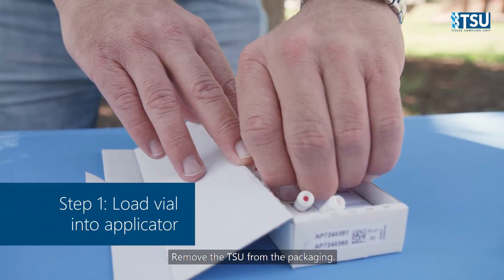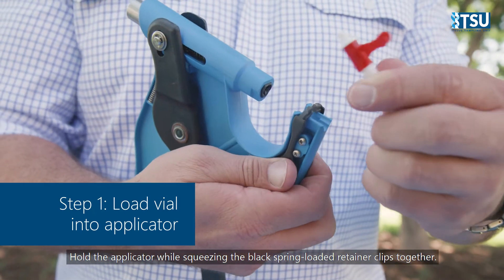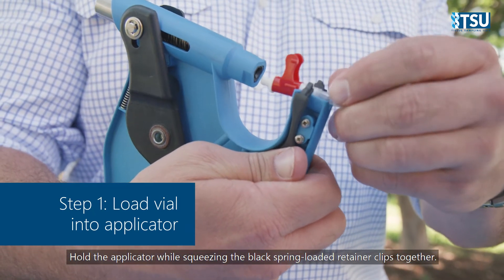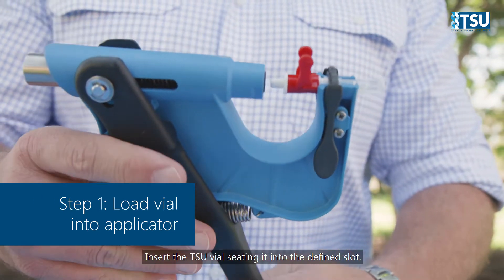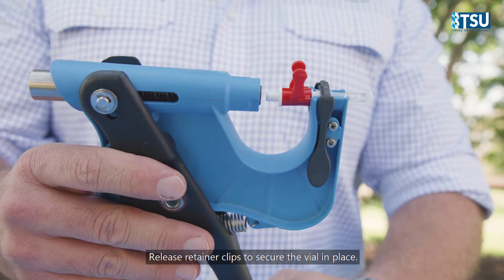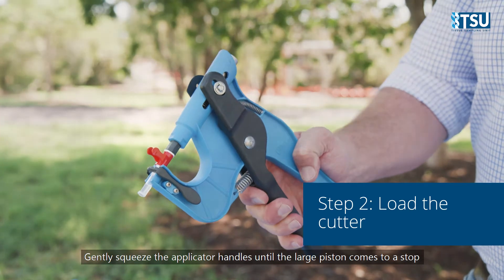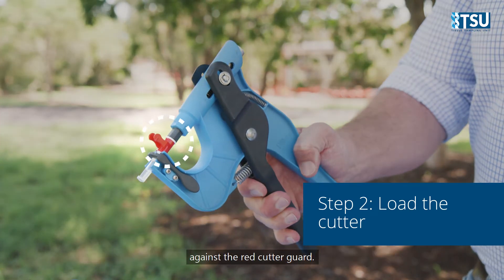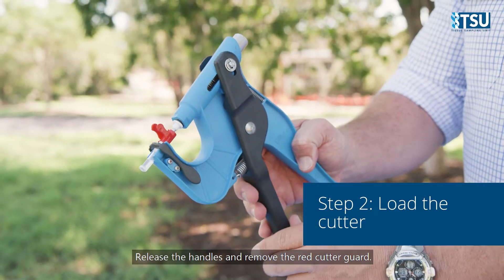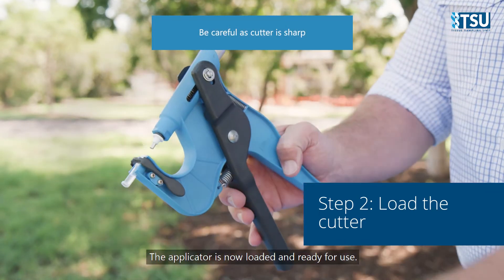Remove the TSU from the packaging. Hold the applicator while squeezing the black spring-loaded retainer clips together. Insert the TSU vial, seating it into the defined slot. Release retainer clips to secure the vial in place. Gently squeeze the applicator handles until the large piston comes to a stop against a red cutter guard. The cutter has now been seated. Release the handles and remove the red cutter guard. The applicator is now loaded and ready for use.